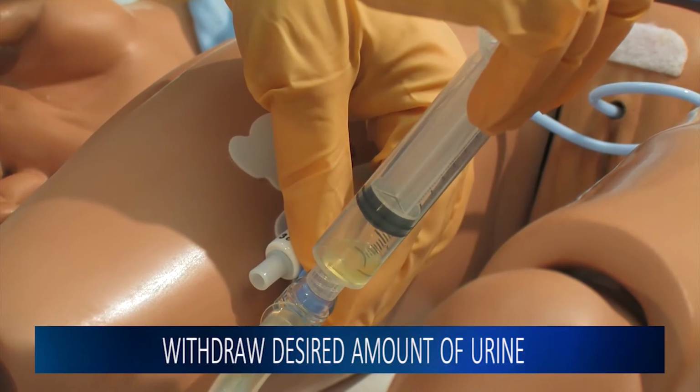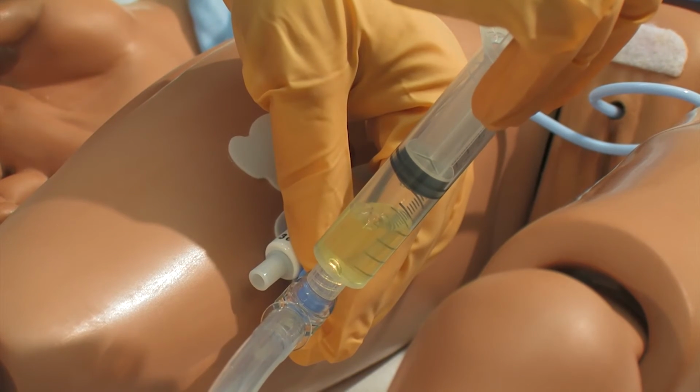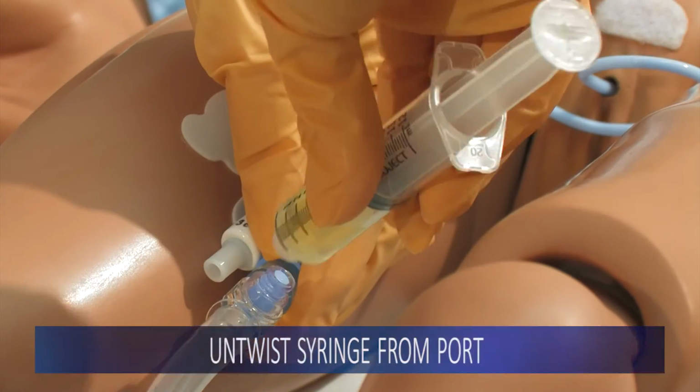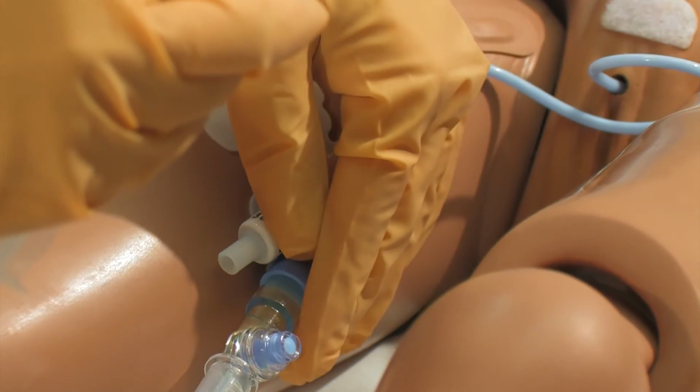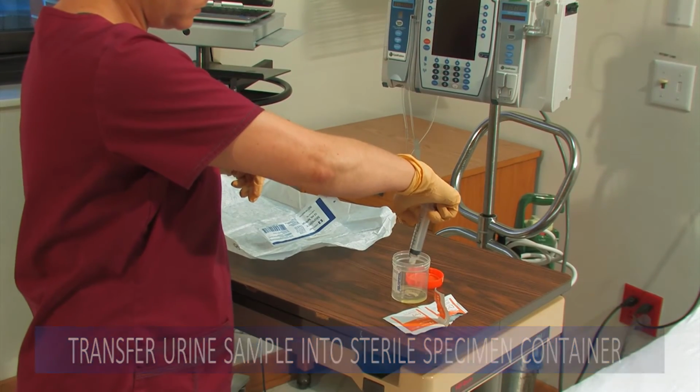Then, withdraw the desired amount of urine. Untwist the syringe from the port. Then, transfer the urine sample into the sterile specimen container.